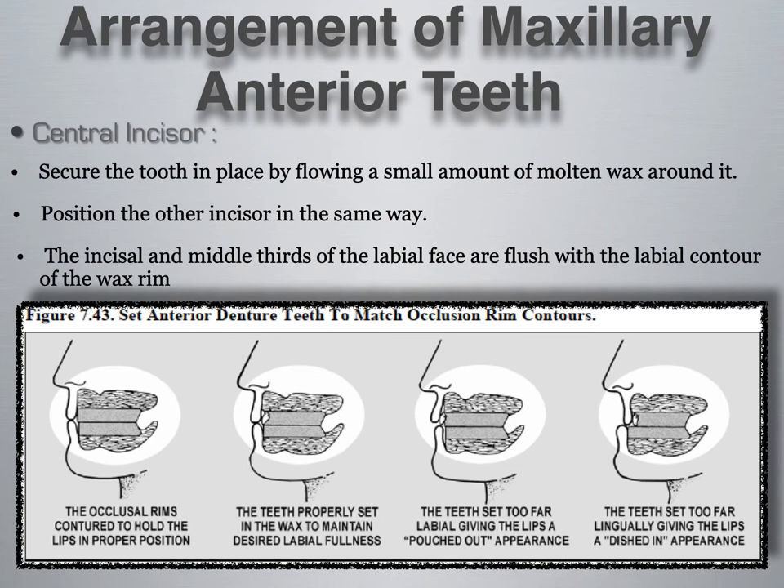As seen in the image below, depending on where the tooth is positioned, it can result in different types of lip support. The first two images show setting a tooth following the proper occlusal rim and therefore proper lip support. If the tooth is in front of the labial support of the occlusal rim, the patient may appear a little buck with extra lip support. Setting the tooth too far into the wax may result in a deficient lip — not enough lip support.